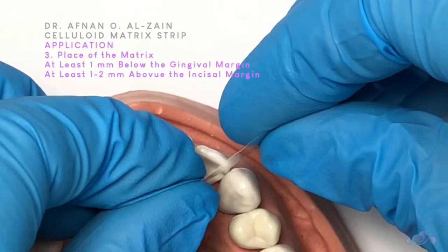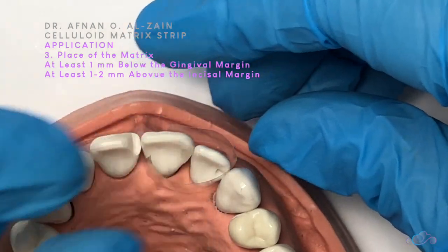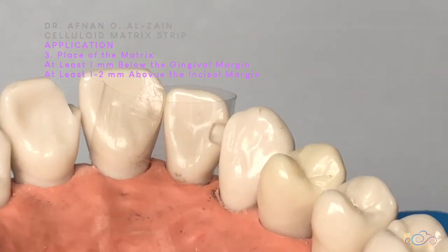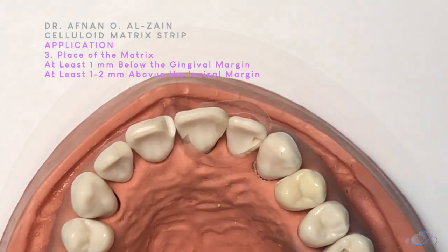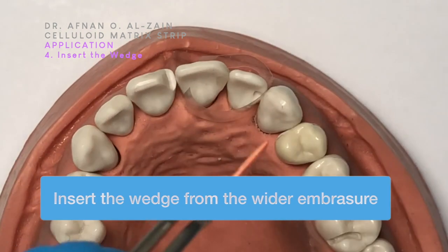How are we going to apply it? We take the piece and place it from the proximal area. We have to make sure it goes below the gingival margins by at least one millimeter and above the incisal margins by at least one to two millimeters. Next, we're going to insert the wedge from the wider embrasure.